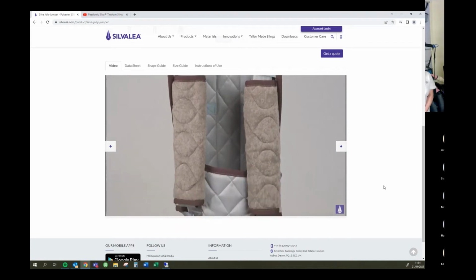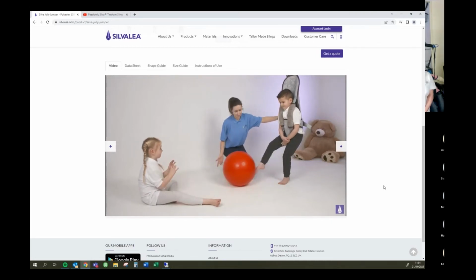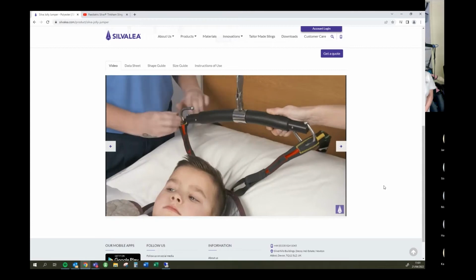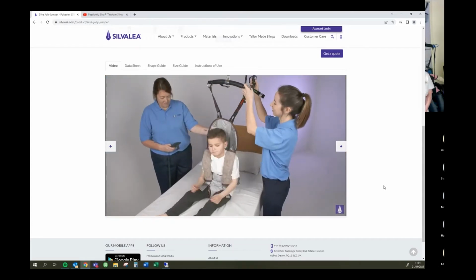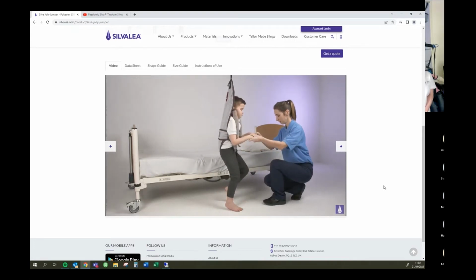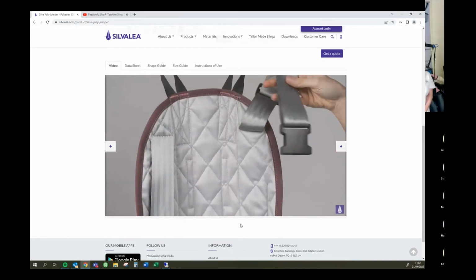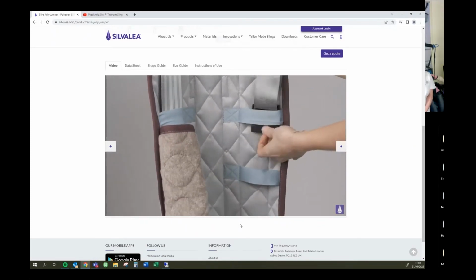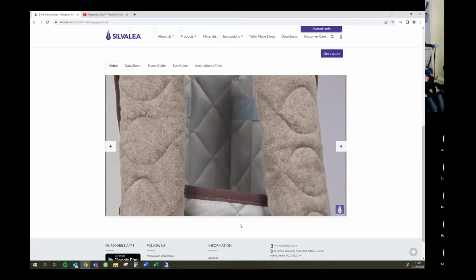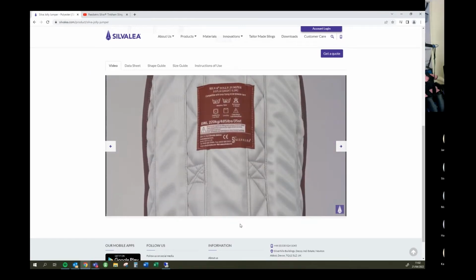So the straps come over the shoulders. There's plenty of room for growth with this one, which is another plus, and it gives good upper body support by those shoulder straps. So the section comes through the groin, connects to the waist section, and then you fix it at the back. So it wraps around to give good hip stability. So it's as clear as it can be. Adjustable tapes go over the shoulders, and then slide through there, you can see the adjustment there for the positioning. Added a little groin section and then it clipped around the back.